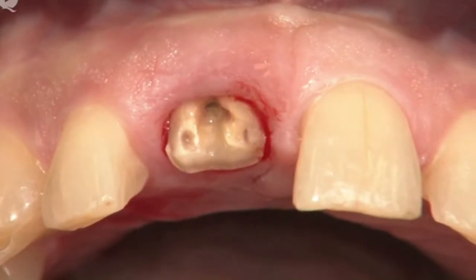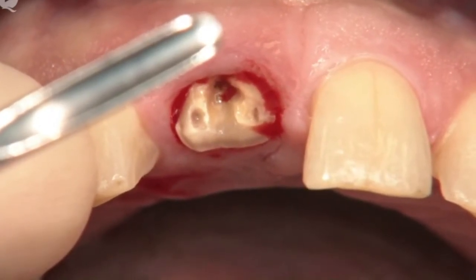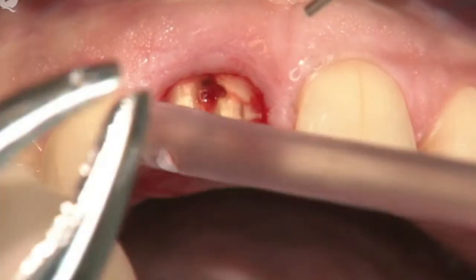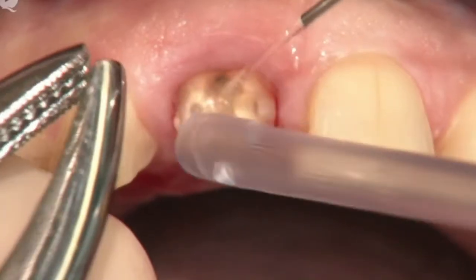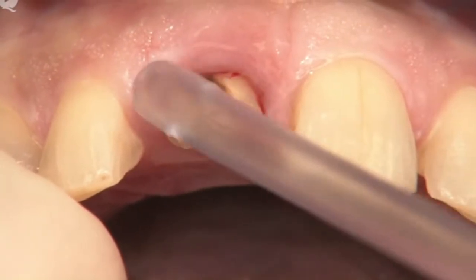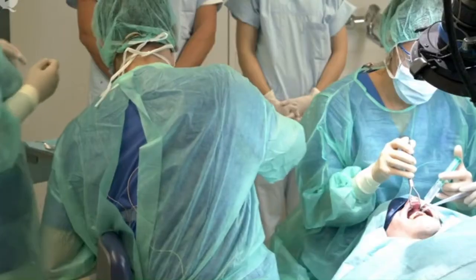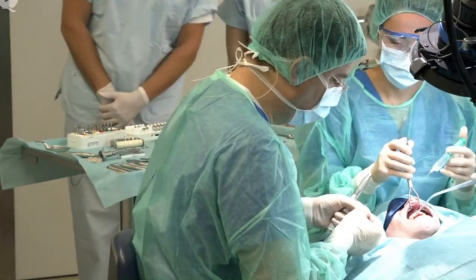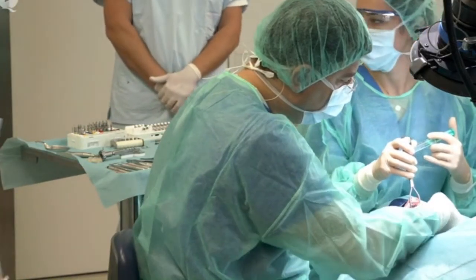Obviously you could also use a dental elevator to luxuate the tooth or use forceps to remove it. There is a 3D radiograph — Professor Schwartz already presented it — and we saw that this tooth is not perfectly round but rather oval. So in order to preserve the vestibular buccal bone plate, I am going to use the Benix extraction system.